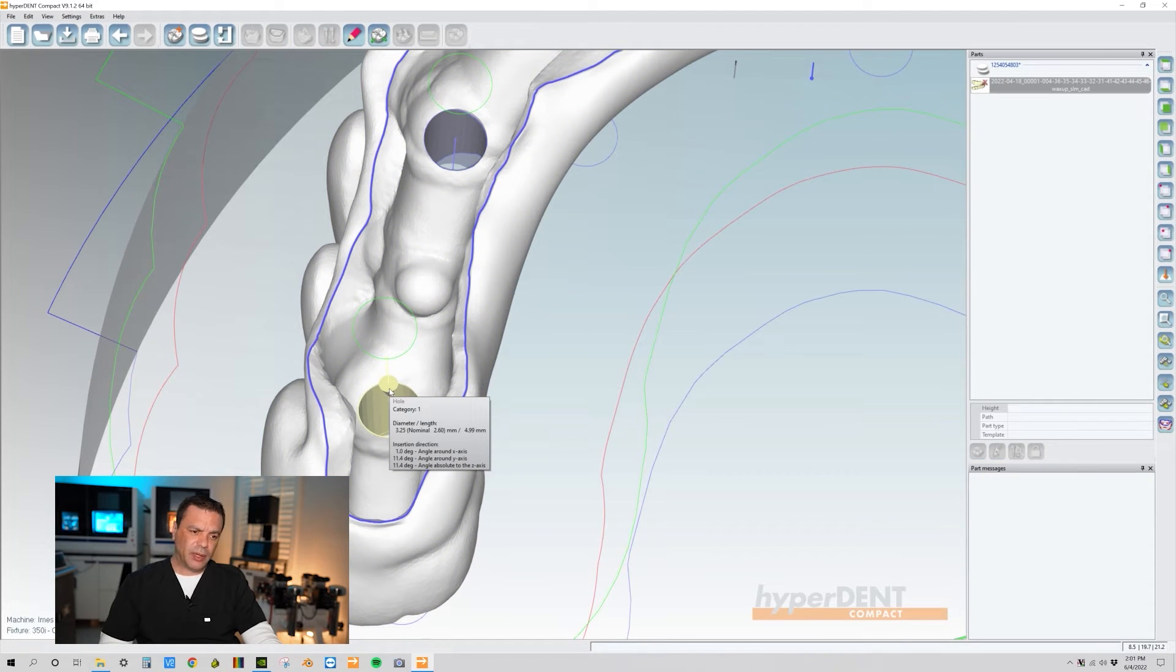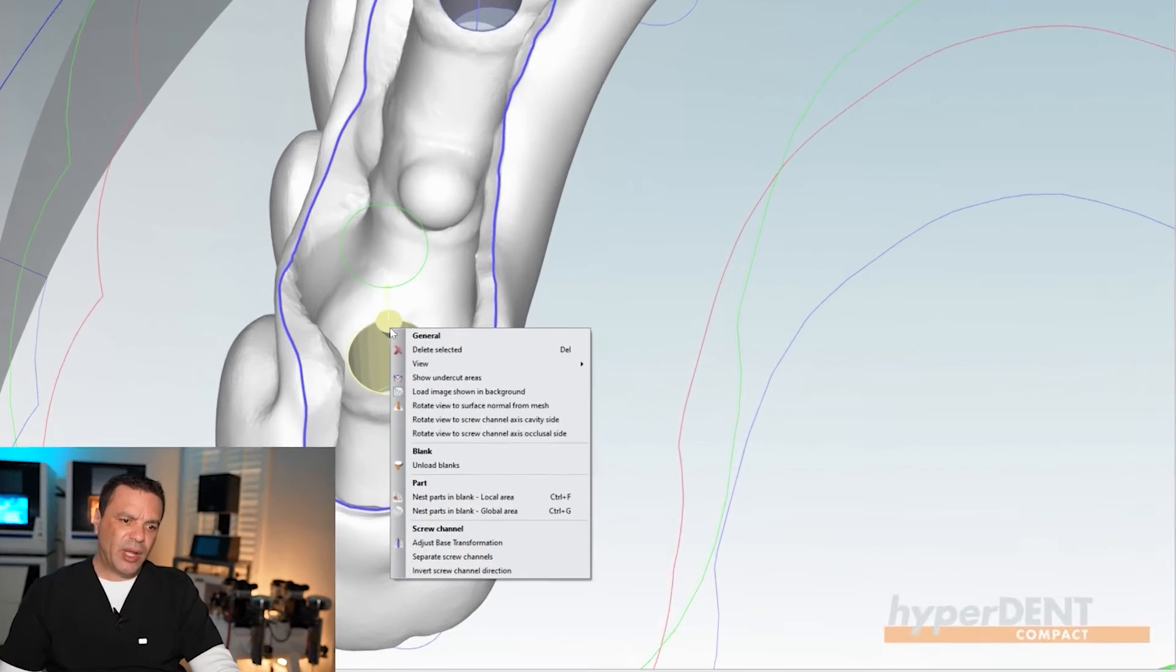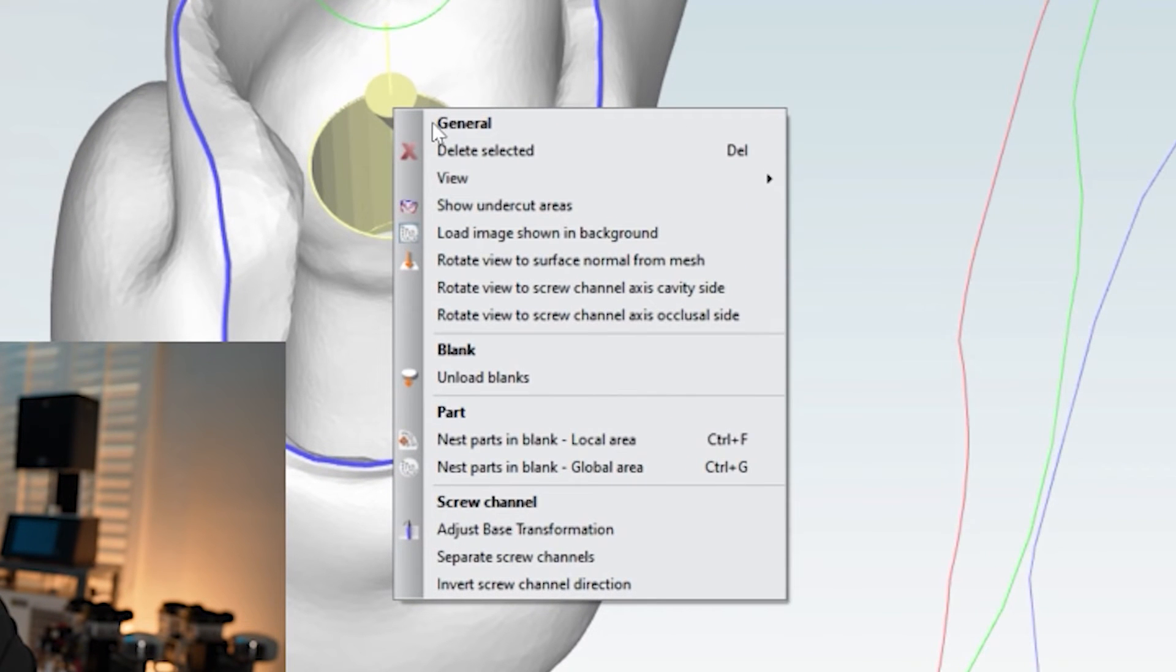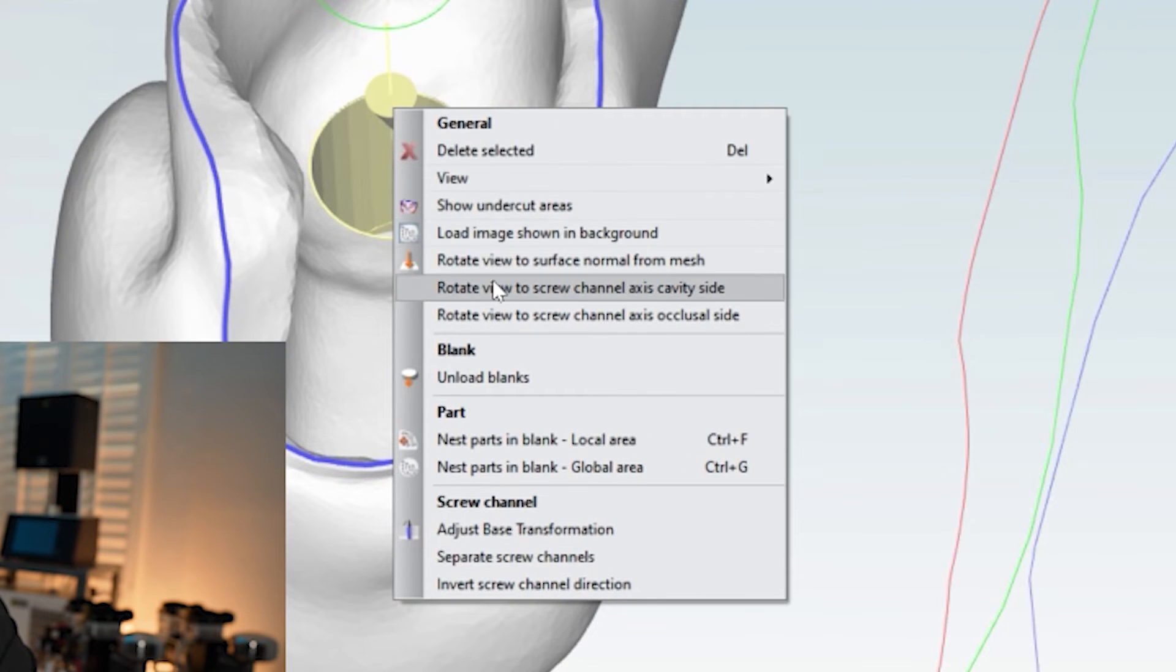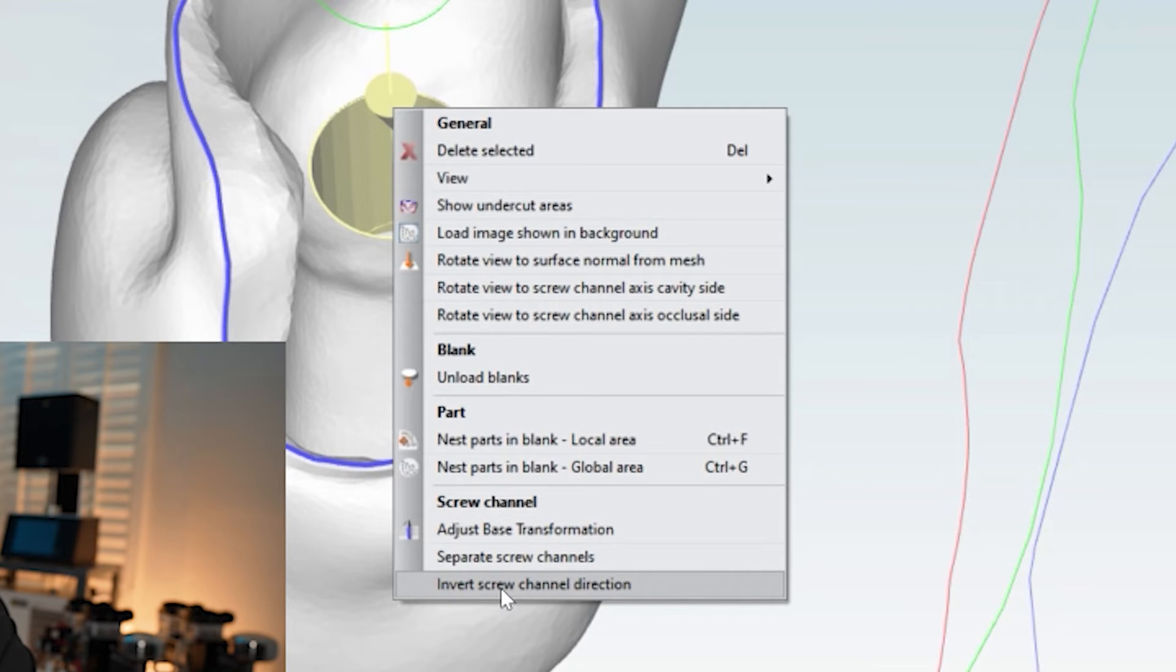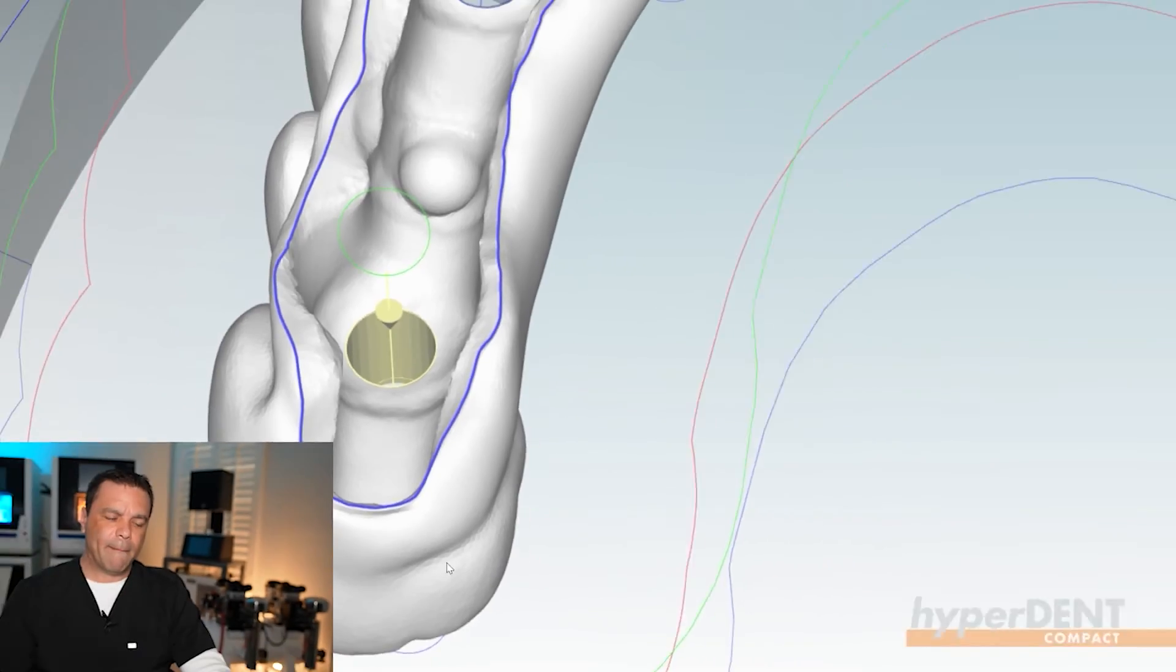it's going to turn yellow. Then right click and we have all these options over here. We're going to go down to the bottom option, the very bottom option that says invert screw channel. Just go ahead and click on that.